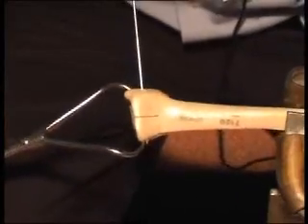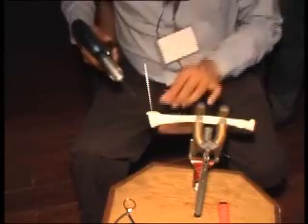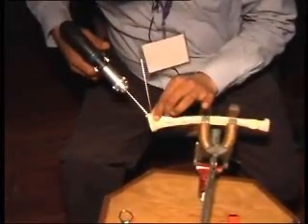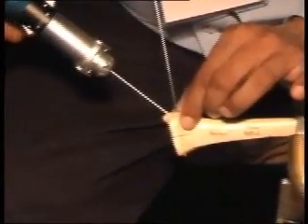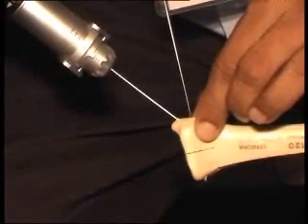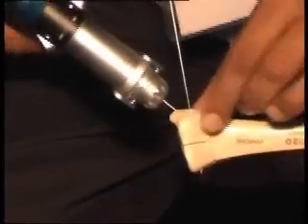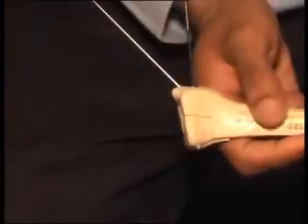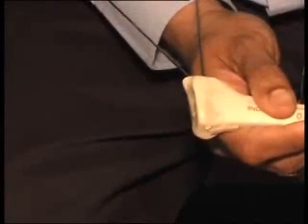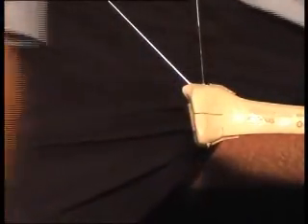This will hold our distal fragments. Because there is no soft tissue attachment, it is difficult to apply a plate directly, so we put another K-wire fixing this distal fragment to the metaphyseal fragment. The fracture is now stable. This is a very difficult and rare situation in an actual clinical scenario, because we don't get such big chunks of bone with no soft tissues attached and no bleeding.